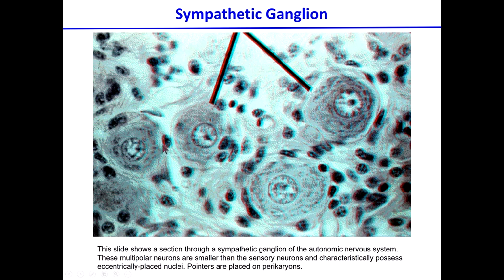Some of them in here might have the myelin, and you can see the Schwann cell folding on top of this one, with the location of the nucleus in a centric to eccentric position. Questions?